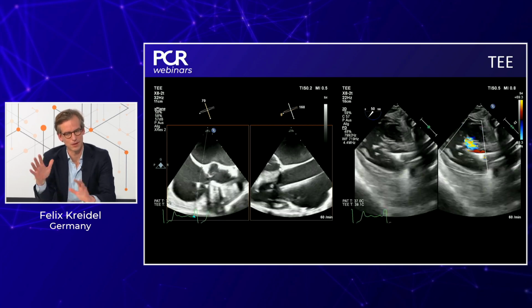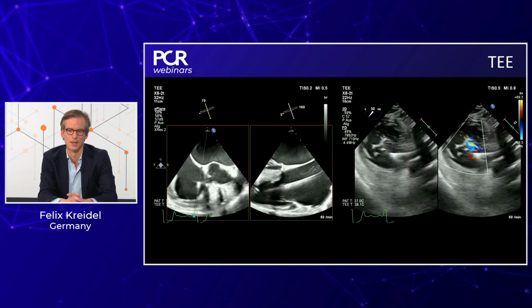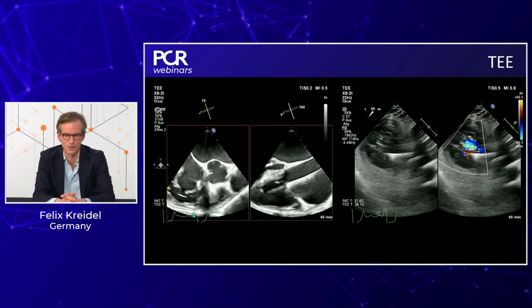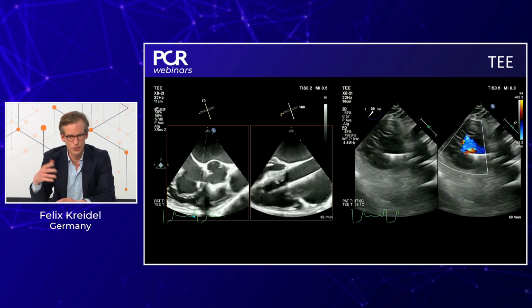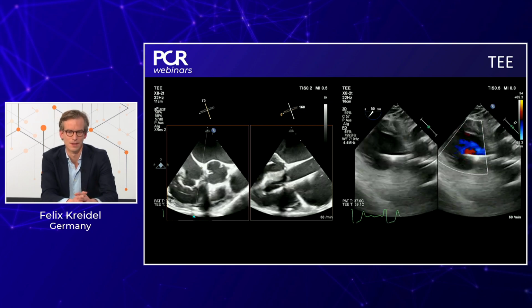And other than that, talking phenotypes, this is a pretty tricuspid-like looking valve. So according to the Hahn classification, this would be a type 1. So huge atria, also a huge left atrium. I'm pretty sure that there's a lot of atrial disease here.